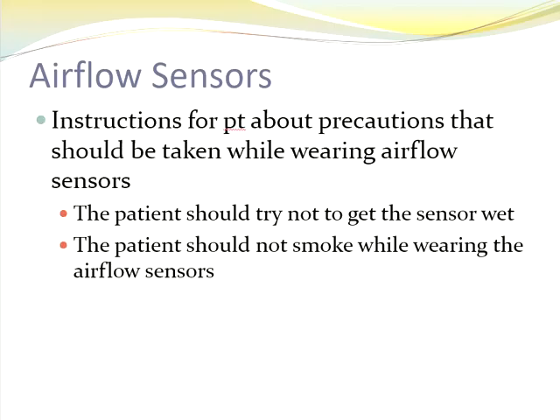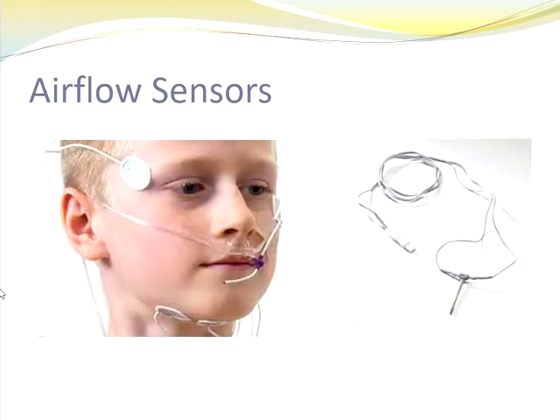Most labs now are smoke-free facilities. Pretty much all hospitals are smoke-free campuses, so patients cannot smoke. You might still come across a private lab that allows patients to go outside to smoke with all the equipment on. That's becoming fewer and farther between. But if they were to smoke, that's one of the ones they cannot exhale their smoke onto the sensors.